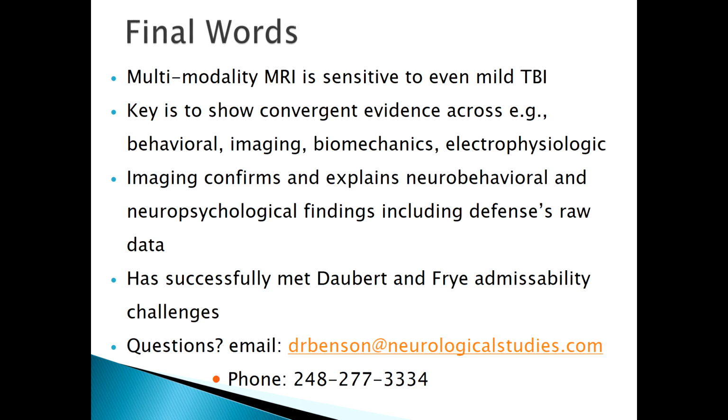So we have somebody here, Paulo Rodriguez. Hello, Paulo. It's asking: are you just using FA? FA can be quite misleading. Well, I'm not sure exactly what you mean by misleading. It's true that there are potential false positives with FA.